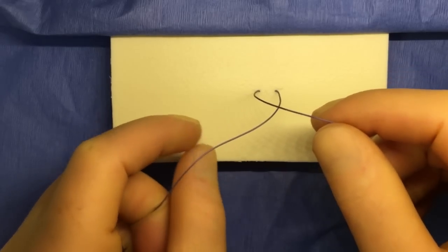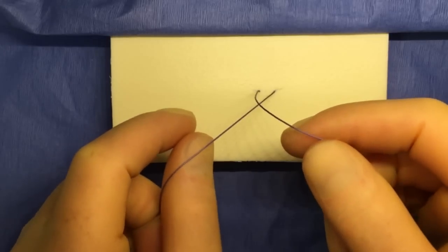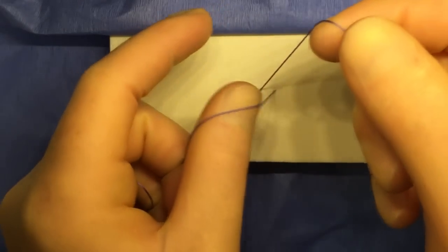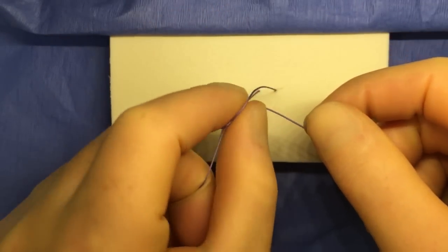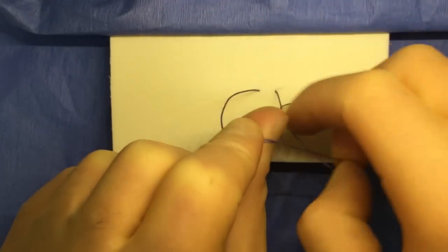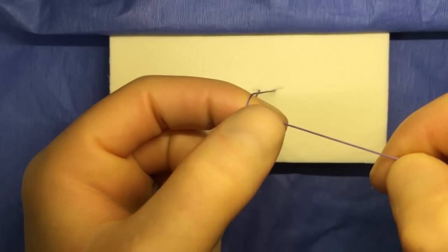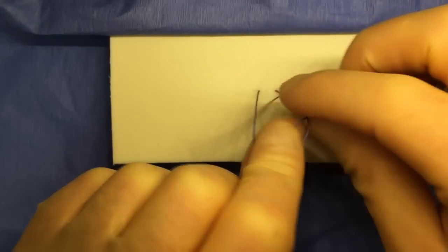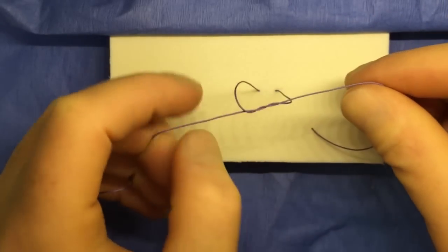To illustrate a standard surgeon's knot using a two-handed technique, one passes the suture twice through the same loop to create a double throw. This throw will hold tension on a wound when needed, but the two-handed technique can be cumbersome and slow.